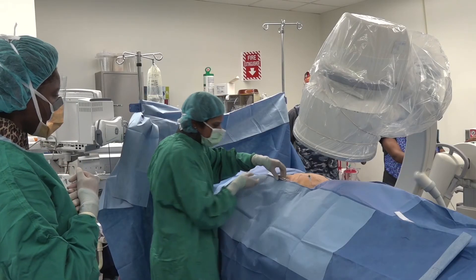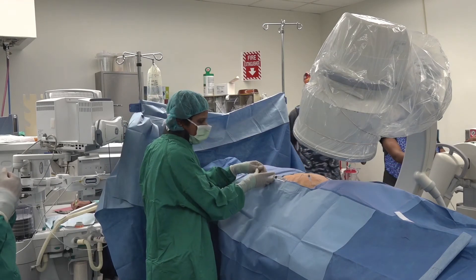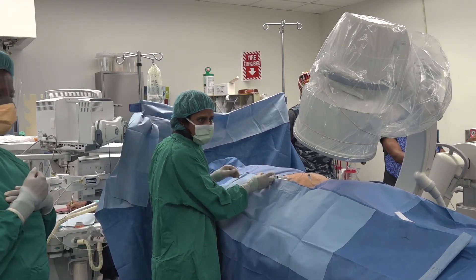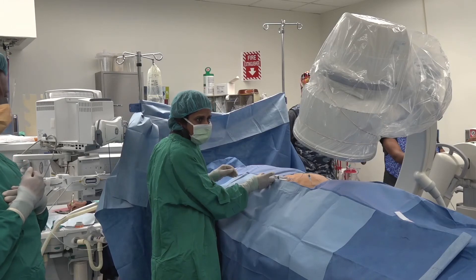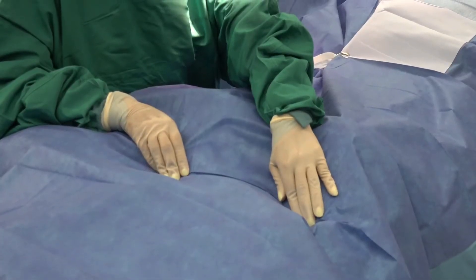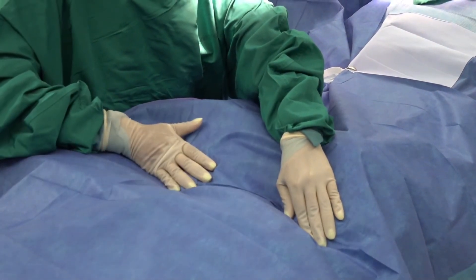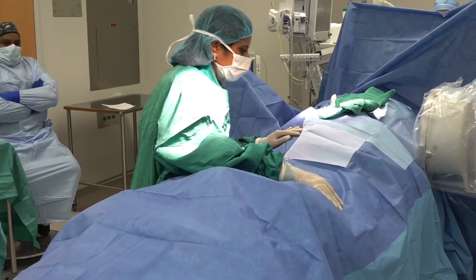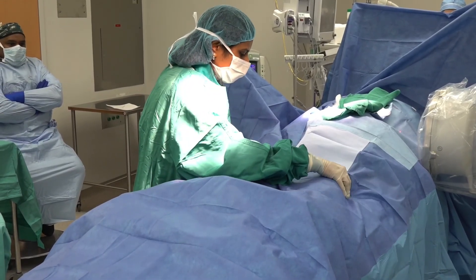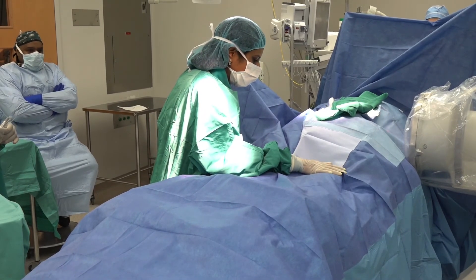We use thin needles to get into the right spot for this procedure. Once the needles are in good position, we inject contrast to make sure the medication will go to the right spot. If the spread looks good, then we go ahead and inject strong local anesthetic or numbing medication. At this time we do a neurological exam to make sure you do not have any new numbness or weakness in your legs or feet. We will ask you to wiggle your toes and bend your knees to make sure nothing unexpected is happening.